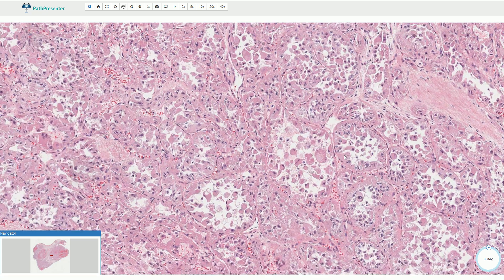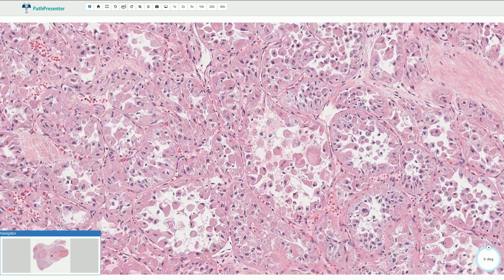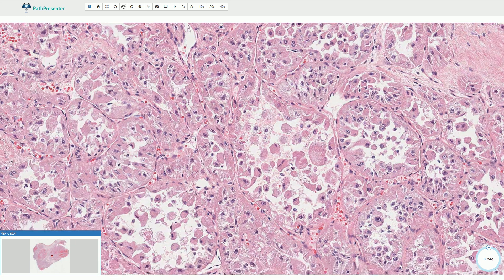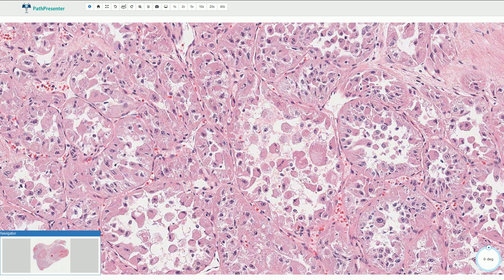Around these nests we can find thin fibrovascular septa, and we can typically see discohesion of the lesional cells inside of these nests — typically in the center — and that creates the so-called pseudo-alveolar pattern.